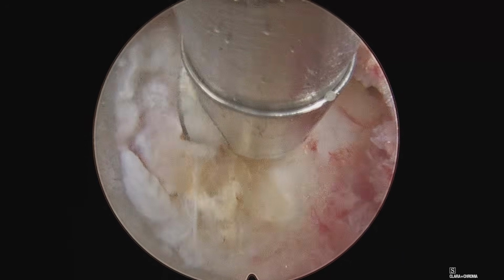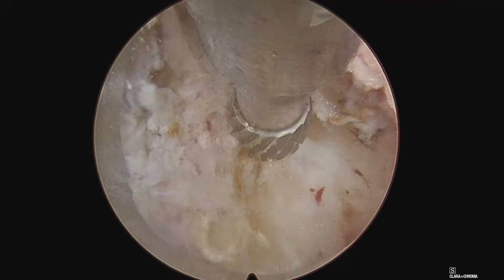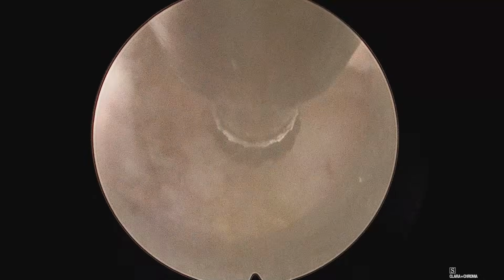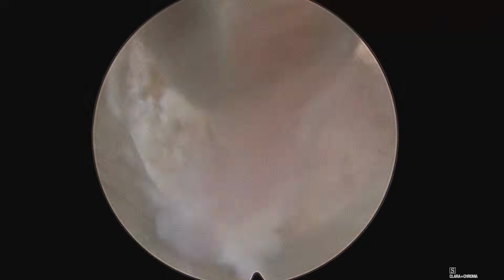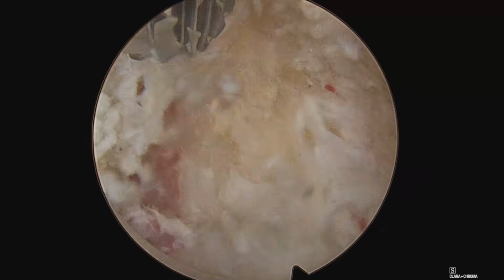Here you can see I'm exposing and clearing the tissue from the bony elements. At 3 o'clock is the cranial L5 lamina, which here I am drilling. Caudally would be S1. You can see the interlaminar space with yellow ligamentum flavum.